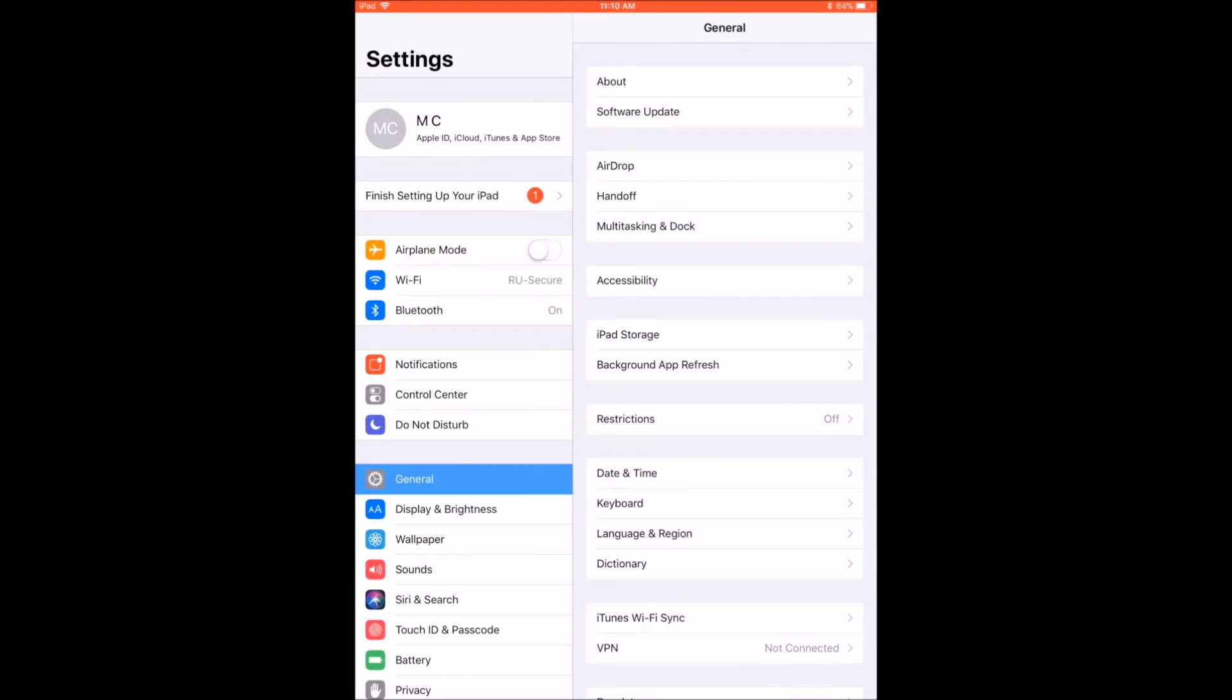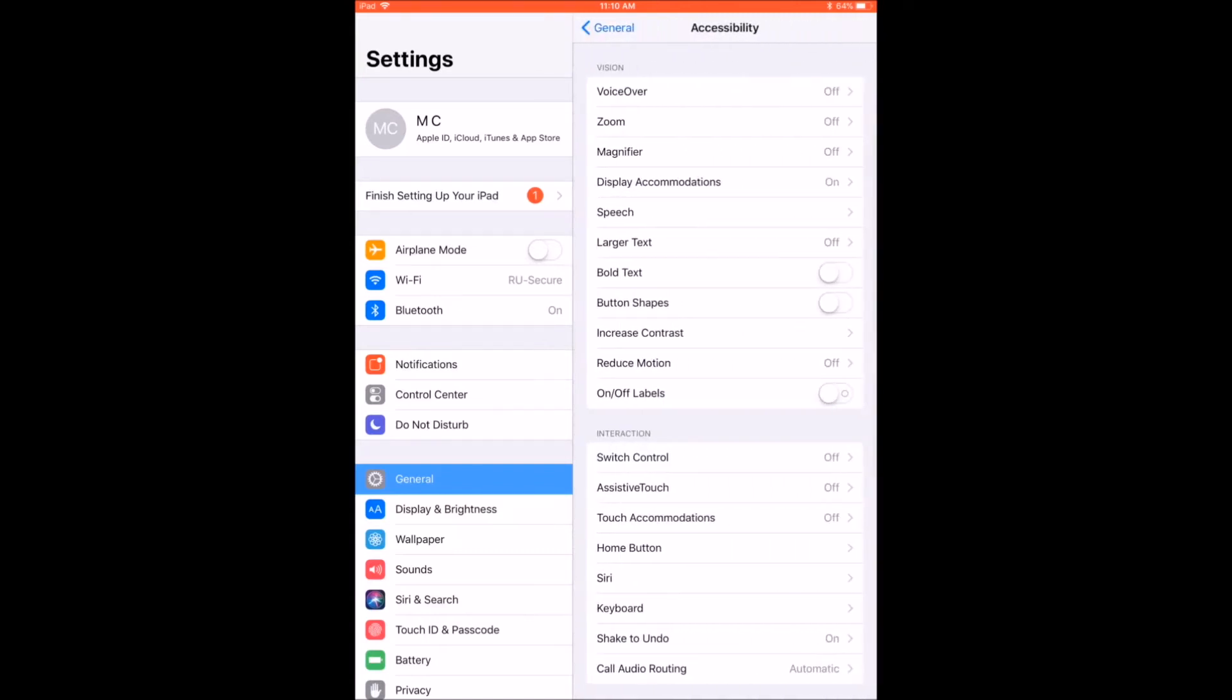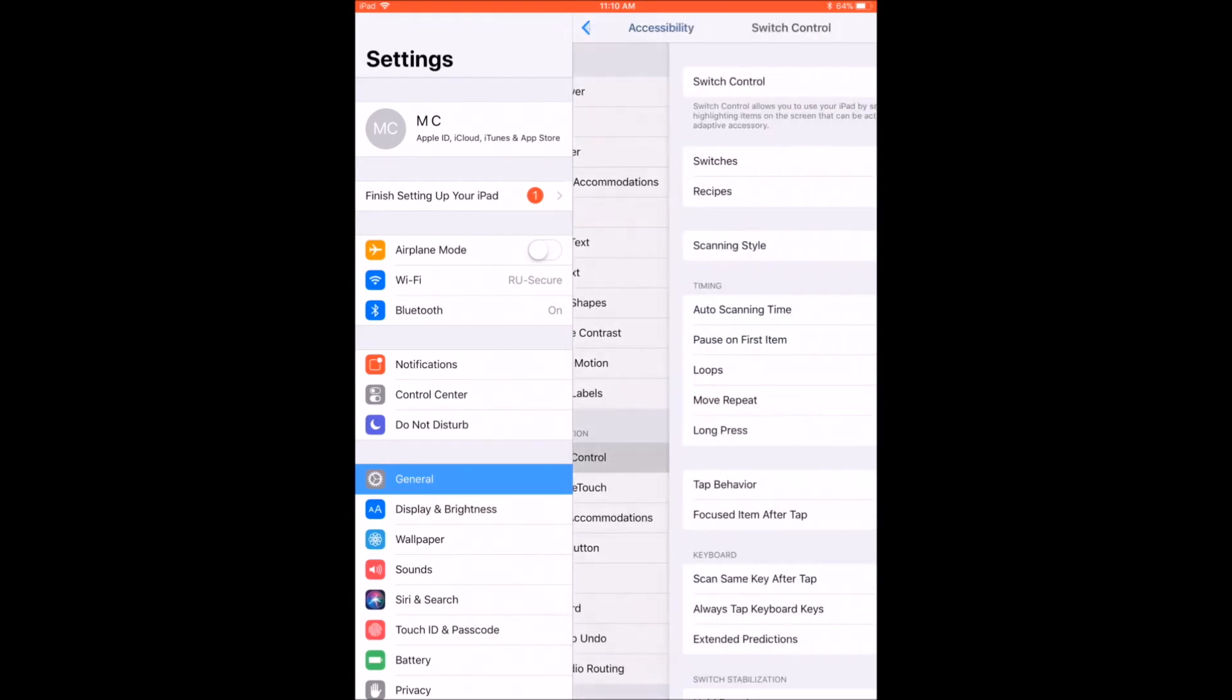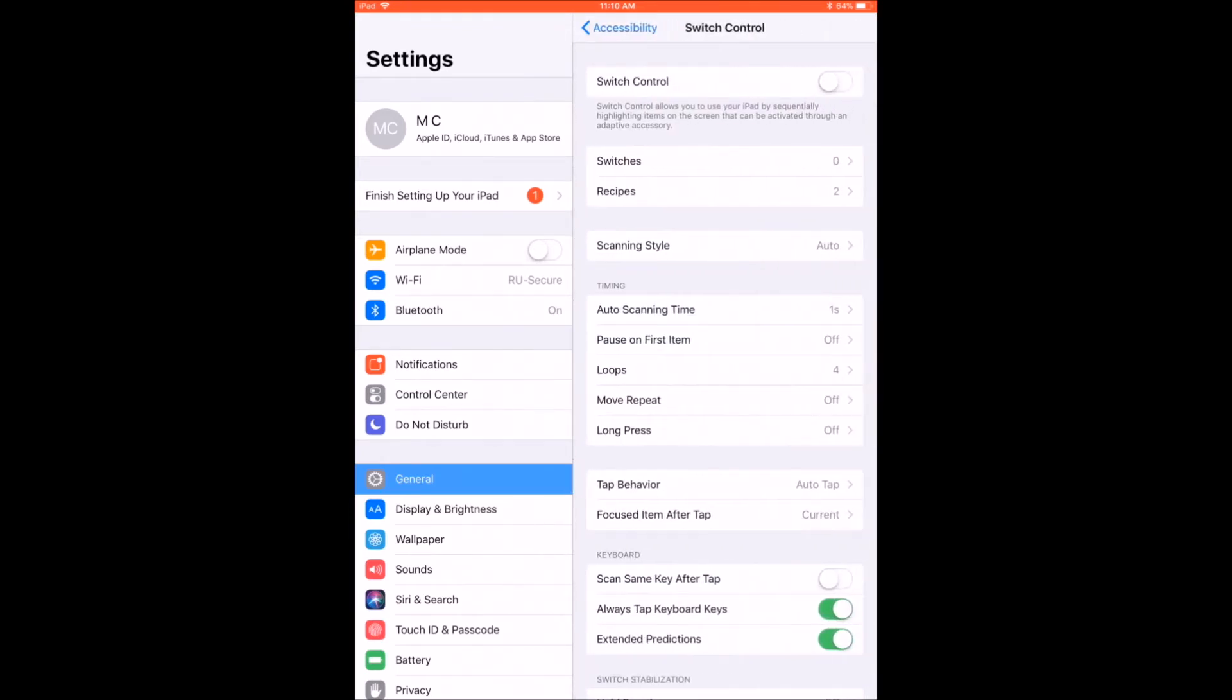To assign actions to your switches in the Switch Control menu, go to Settings, General, Accessibility, and then scroll down and click on Switch Control.